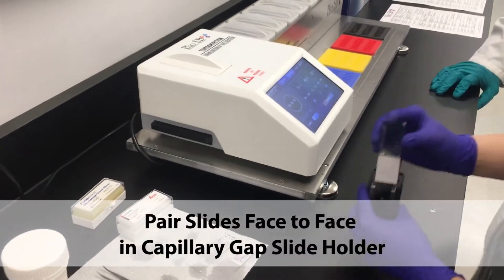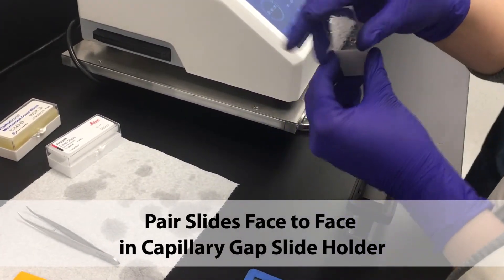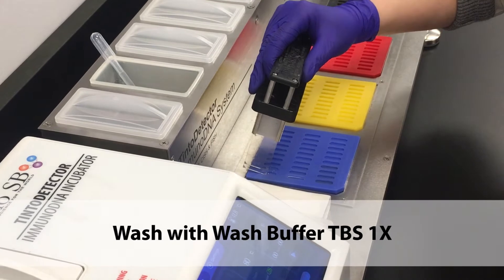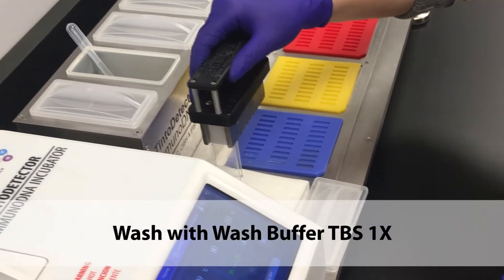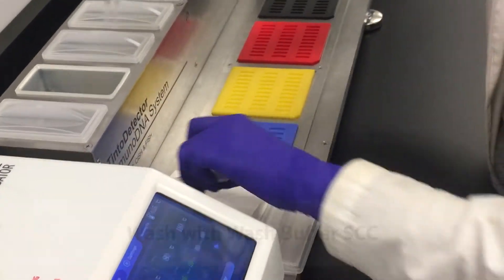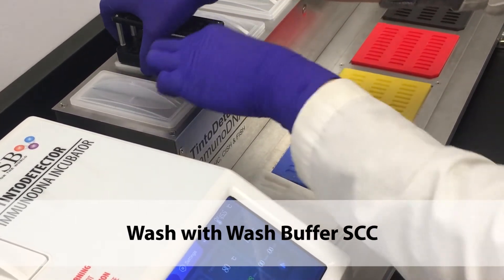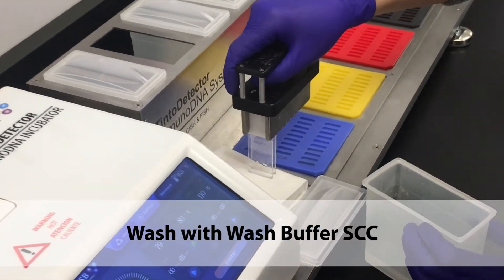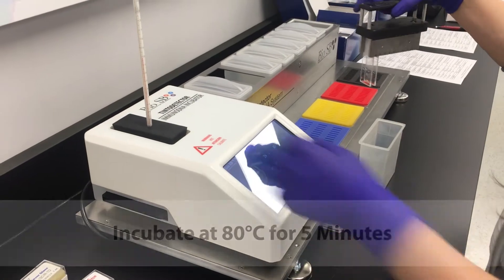Pair the slides face-to-face again in the capillary gap slide holder. Wash with wash buffer TBS, then wash buffer SSC for stringency wash.